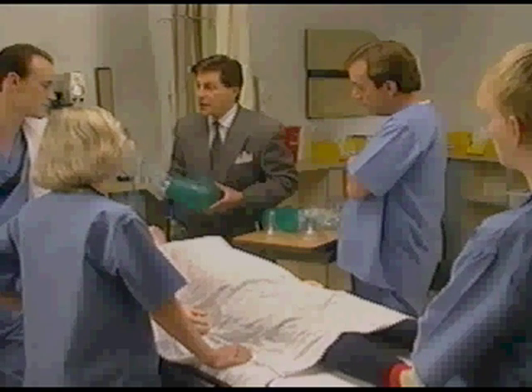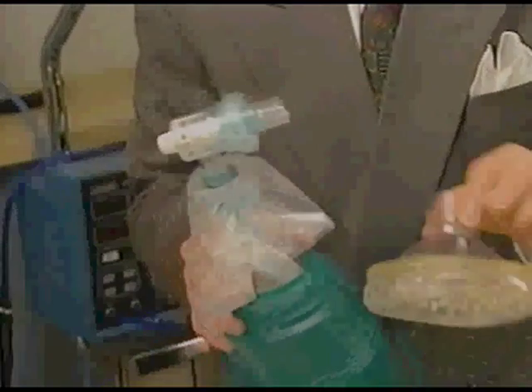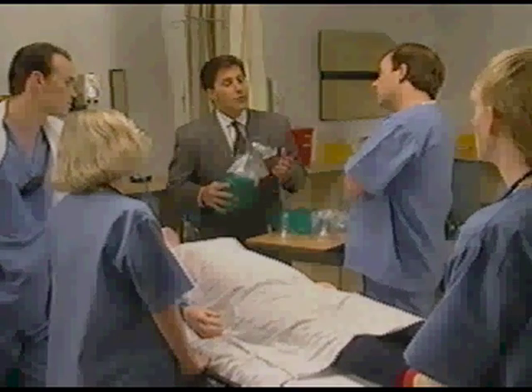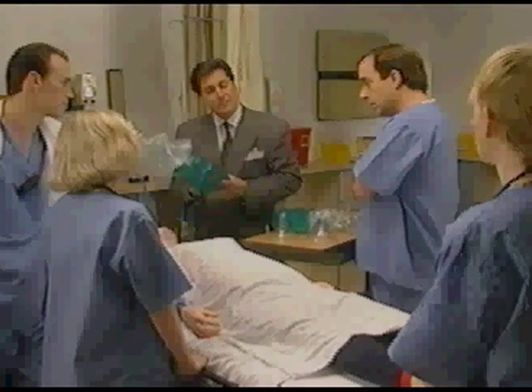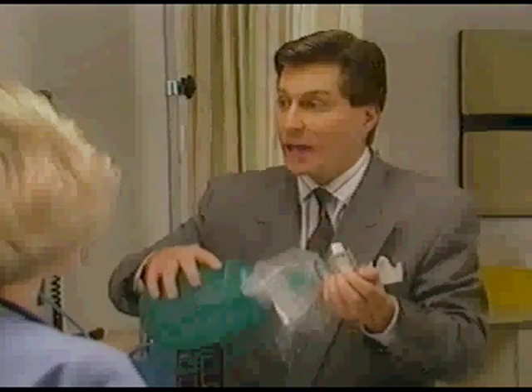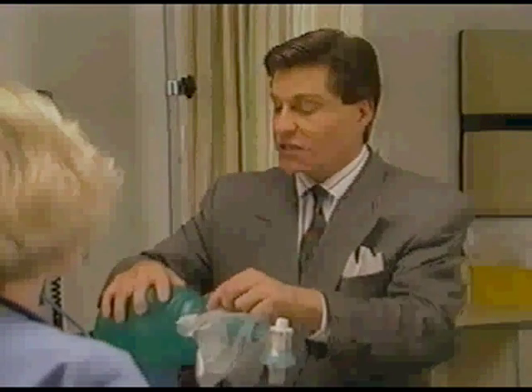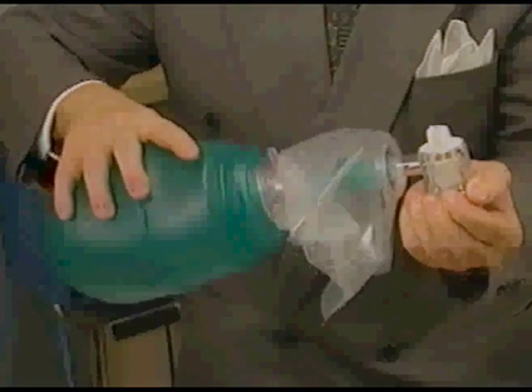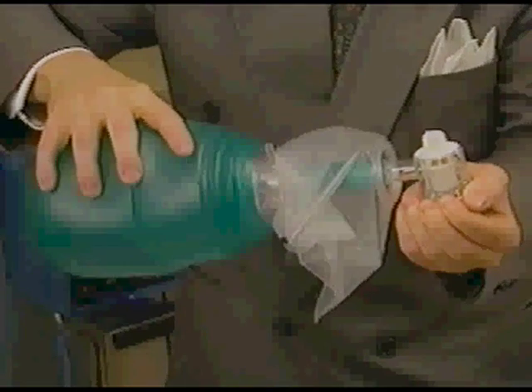There's nothing to search for in inventory or to misplace. BagEasy comes ready to connect to a standard artificial airway, or you can just add the mask at the front. To test the bag, the first thing you should do with this or any other bag is to perform a functional test. It only takes a matter of seconds, and because bag performance is so critical, it's well worth the effort. Block the patient valve and hold the bag in a horizontal position with the oxygen port facing up. Occlude the patient valve and give the bag a nice slow squeeze.